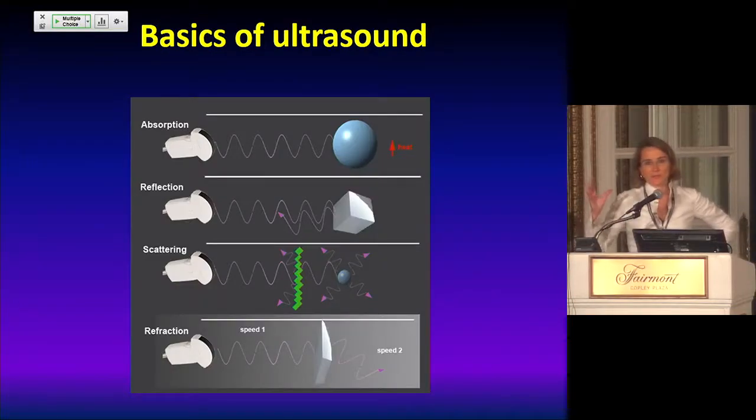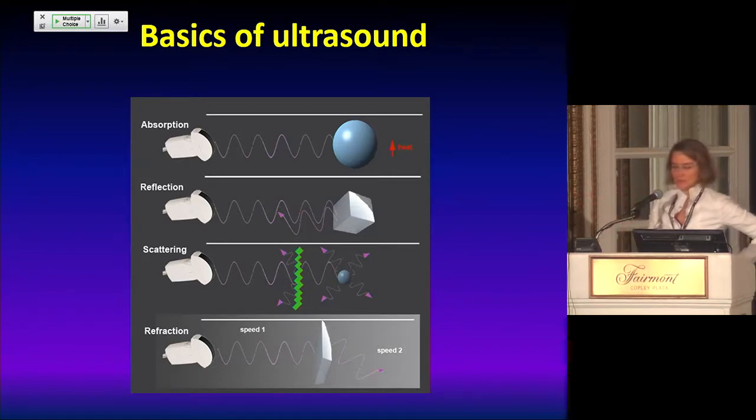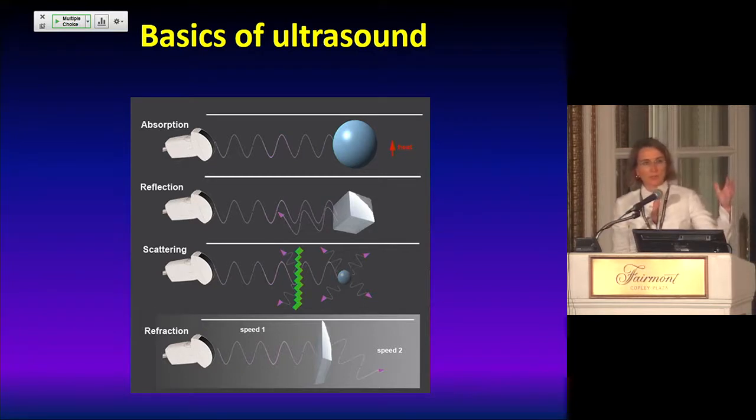All right, let's try to think about ultrasound and what it actually does and means. You have an ultrasound machine with a probe that has crystals in it. They emit a mechanical wave into the body. It will hit structures in your body and then will be reflected, absorbed, or scattered. So if a wave hits a structure that will absorb everything, it will be depicted black. That's usually fluid. If it hits something that reflects everything back, it's something that has a high density, and it is usually bone or stone. And scattering or refraction of the wave will produce an image that has different shades of gray.